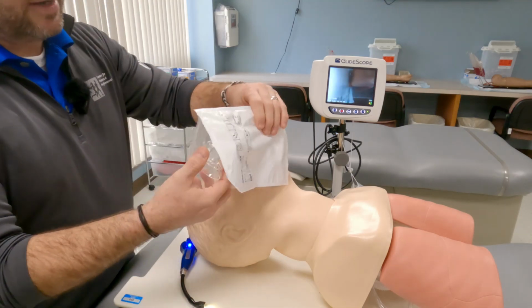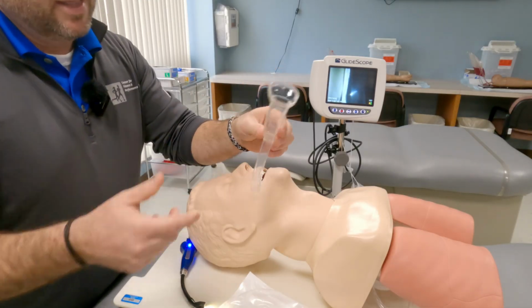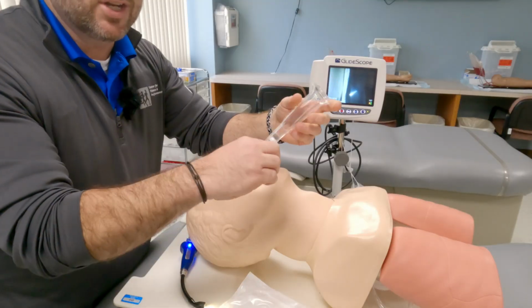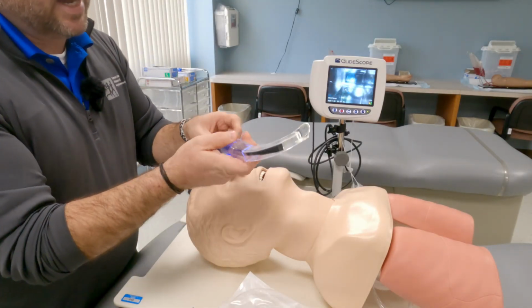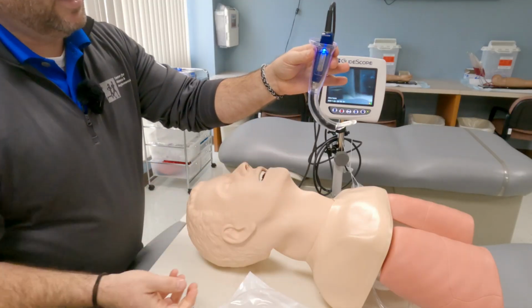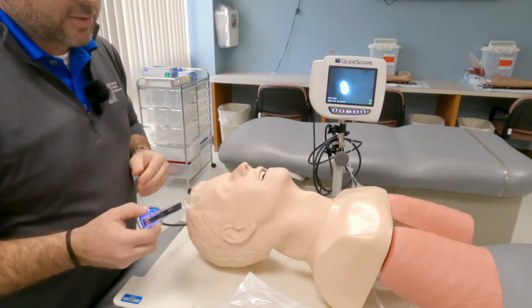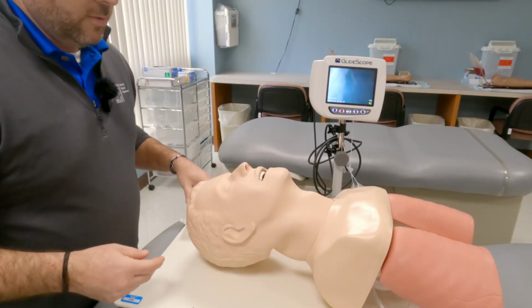We're going to use a device called a GVL. This is just specific for this type of device. This is a disposable piece. It acts like the blade. You notice it's kind of rigid, and the light actually goes inside of it, and it's held like this. So we have the light on. Everything is ready here. We'll leave this inside of the package just so we're not getting a lot of things on it.